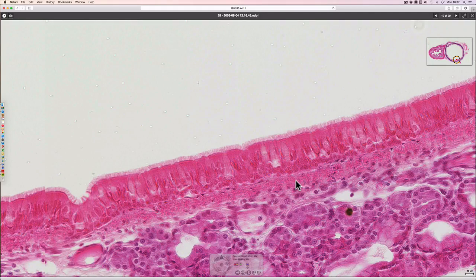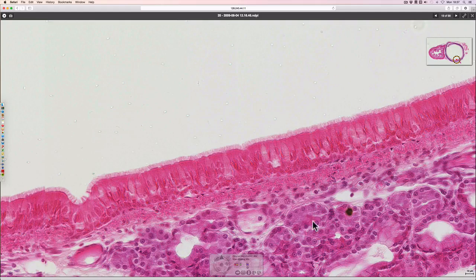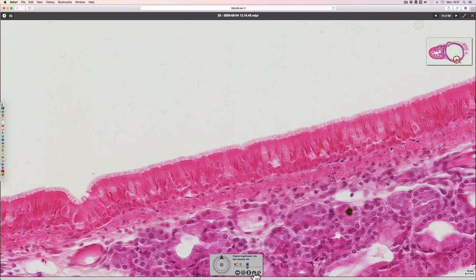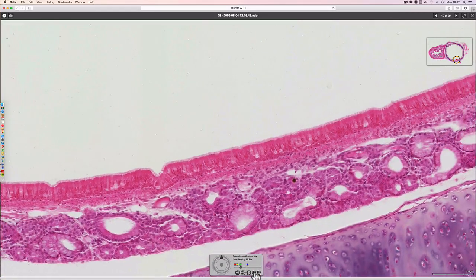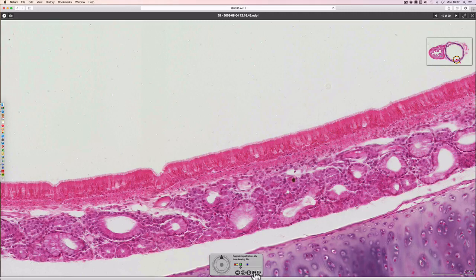Beneath that, in this particular sample, there are some glands. These are connected to the mucosal surface and are producing a mixture of serous and mucus secretions. We have a variety of different types of mucus that we can produce in our respiratory systems.